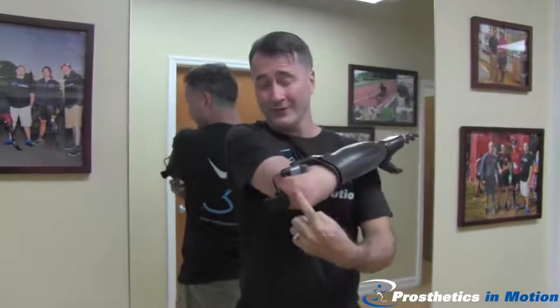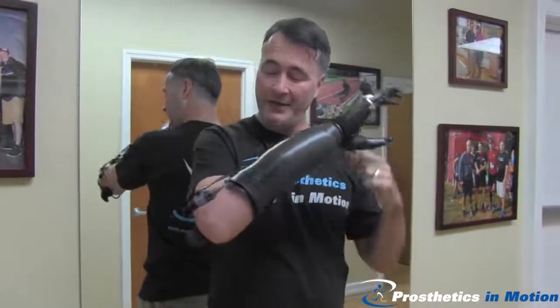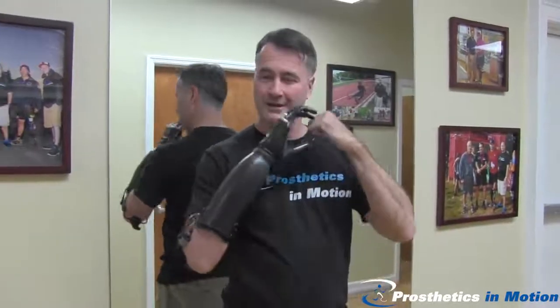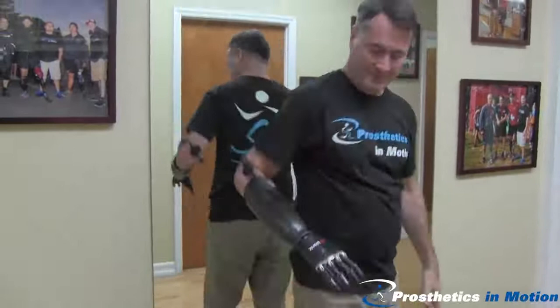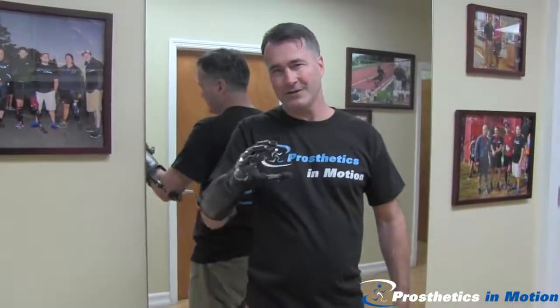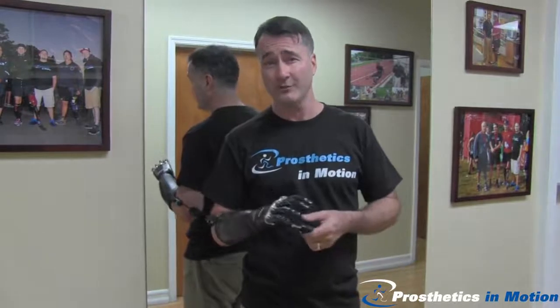To put it on, I just roll into this little suspension cuff. It's from Toughwear Prosthetics and it allows me to have full range of motion. I can get my hand to my mouth, I can scratch the back of my neck, I can reach behind me, and I can even capture some pronation and supination, which I could never do in any of the other hands I tried before.